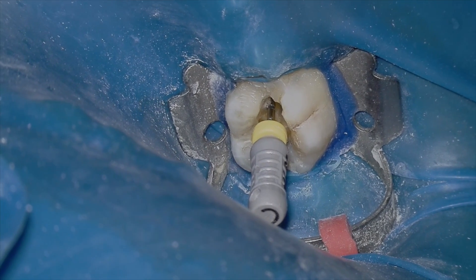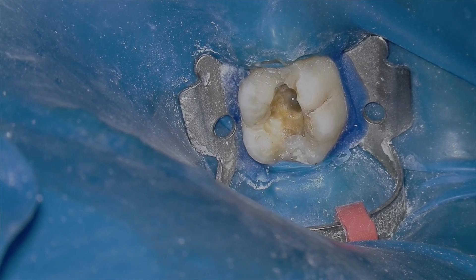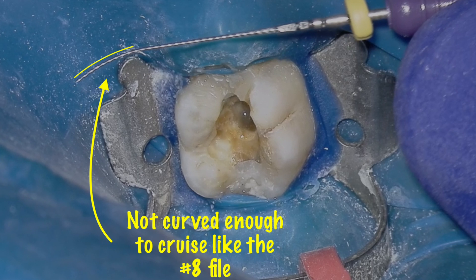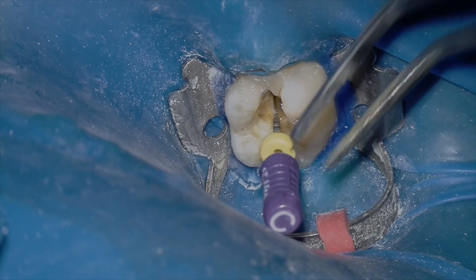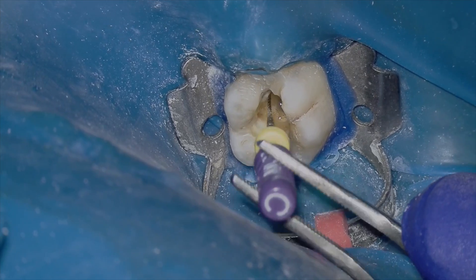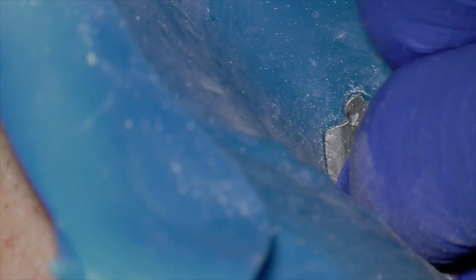Here's my #10 file, but I haven't curved it enough — that was not intentional. You'll see it just will not progress apically. I place it in the mesolingual canal of tooth #46 and have my uni-directional stopper aimed towards the buccal, then I'm trying to spin it to the distobuccal, which I know is the direction of that curve, but it just won't go.